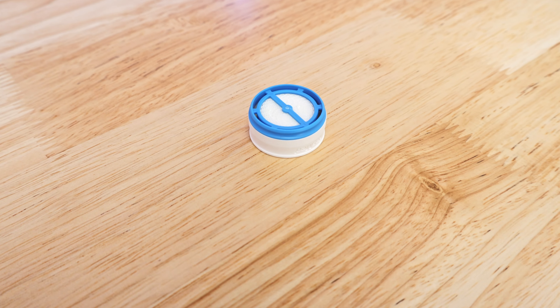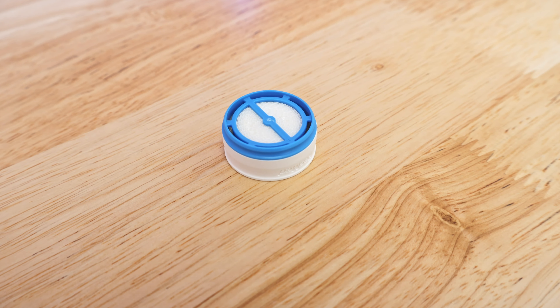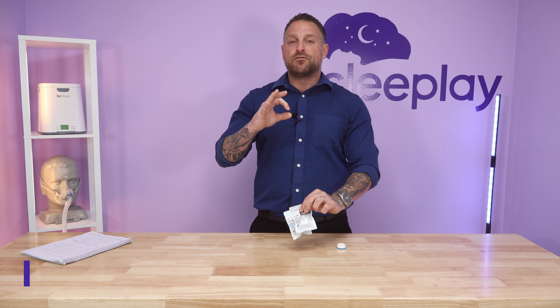These two standard models go into the N20, the N30, and the P10 masks — those are nasal masks. The bigger disc of the Humidex is for the F20 mask.